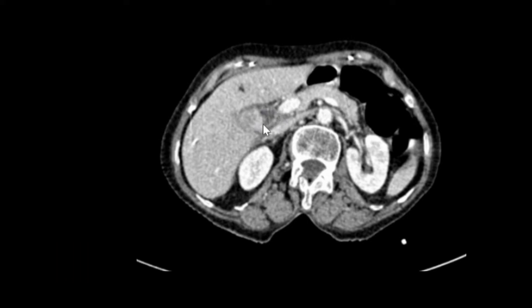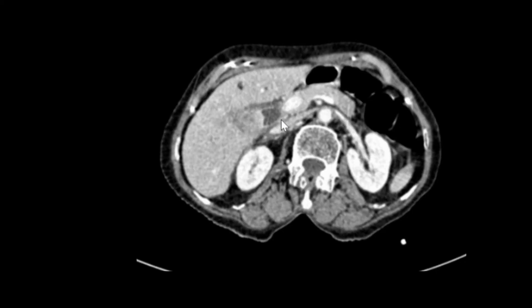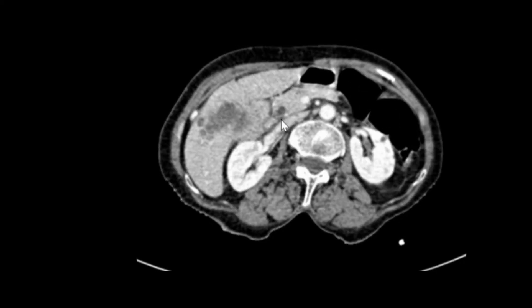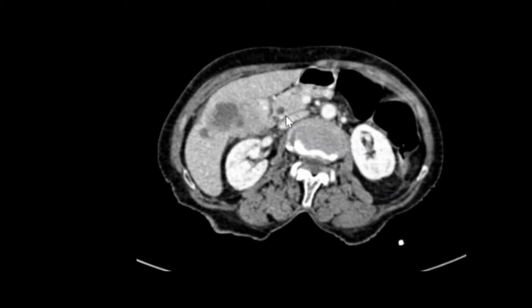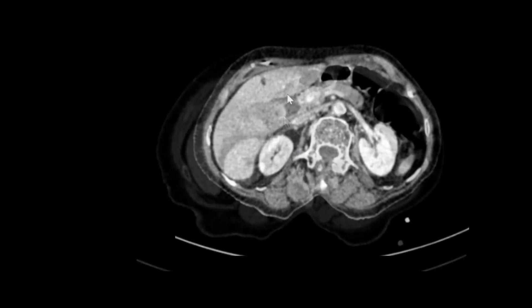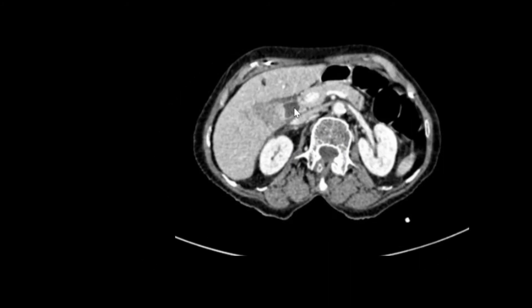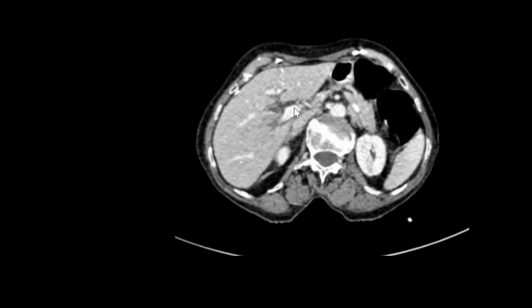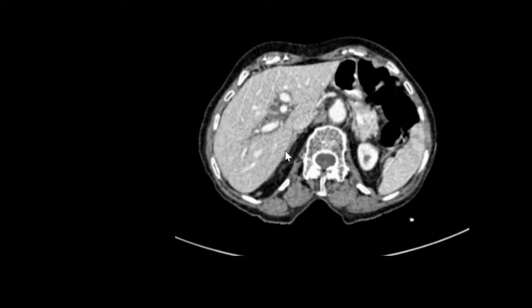The common bile duct shows a dilated lumen. As we move down, seeing the course of the common bile duct, we can see it dilated entirely throughout the course. And as the common bile duct is dilated, we can see upstream IHBRD — that is, intrahepatic biliary radical dilatation.